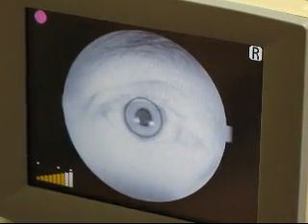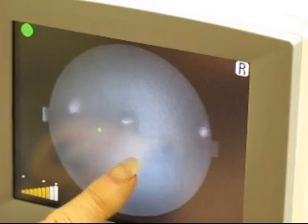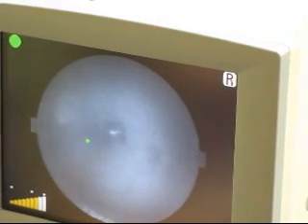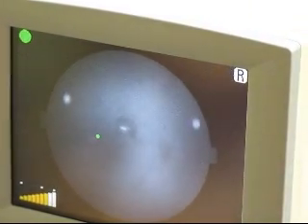we press the alignment button and then we look for the two dots and we make those more focused by pushing or in this case pulling the joystick towards us, lining them up either up and down by turning the blue knob.